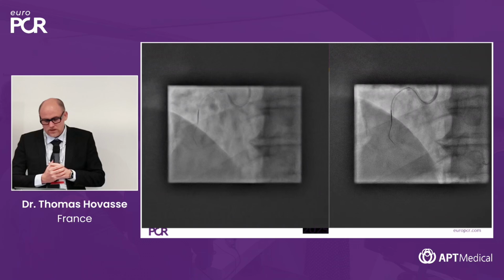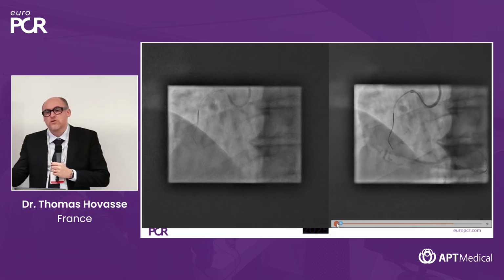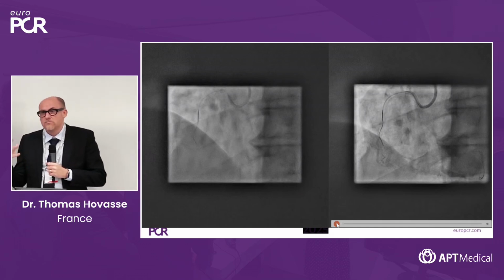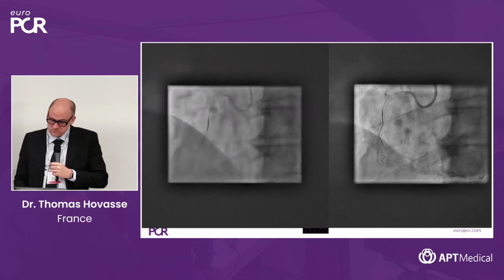Gladius EX wire. So this case was performed by my dear associate, and for me, I would rather use a soft wire to begin, because the Gladius is a very nice wire, but you will go more easily in the subintimal space, and maybe it works to spare 5 or 10 minutes with a softer wire, XT, XTA, XTR, whatever you want, and then switch to the Gladius. So the Gladius here you see is going down.